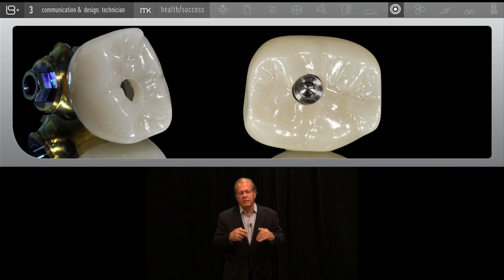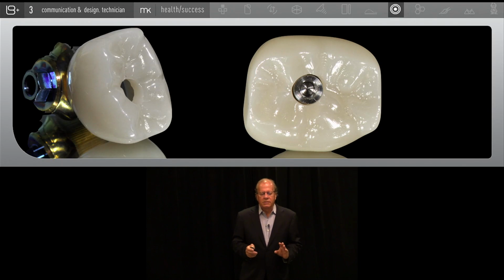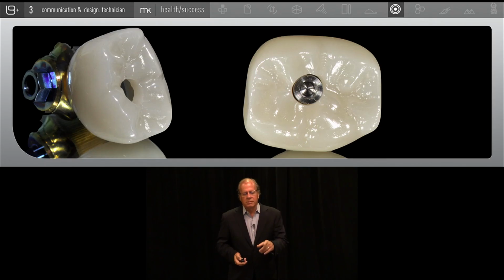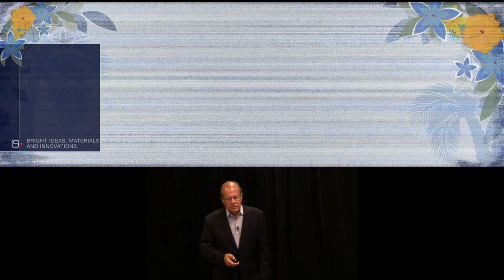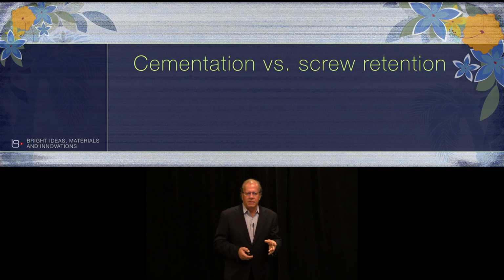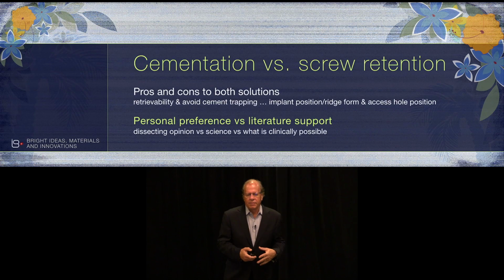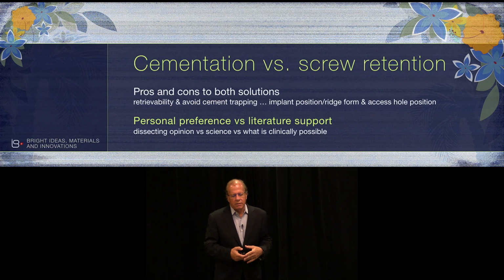You notice the milling of the ceramic goes down into the chimney so that we can treat that area and bond something into the, hopefully, small hole on the occlusal surface, and make it disappear, and its associated metal stem. So that leads me into a very brief explanation of how this helps me in terms of cementation when I have to cement it.